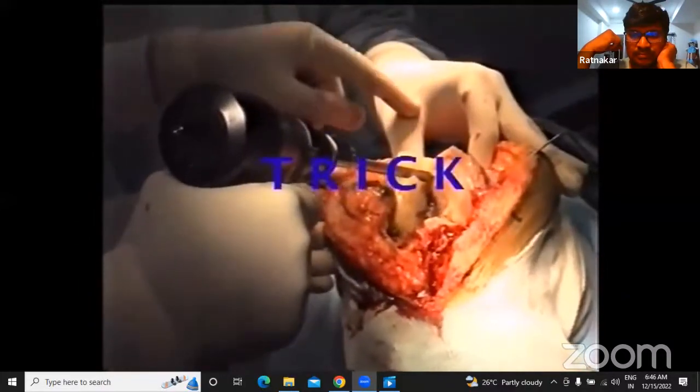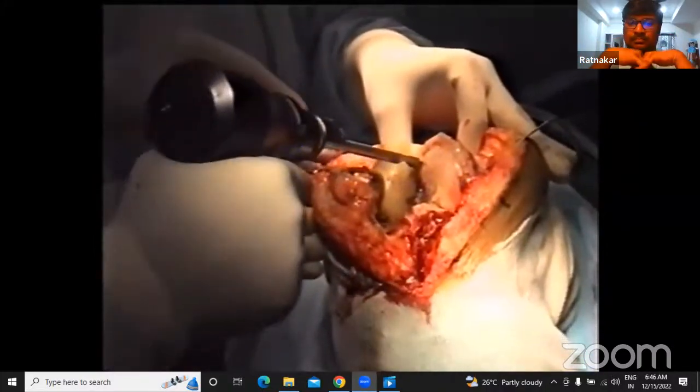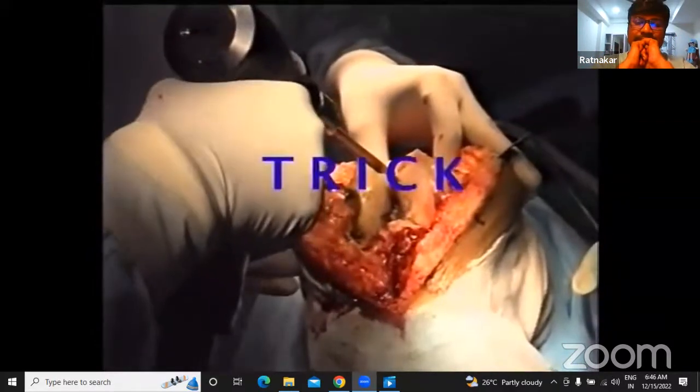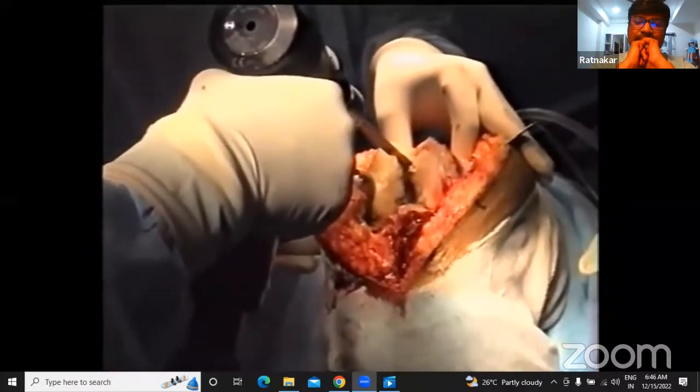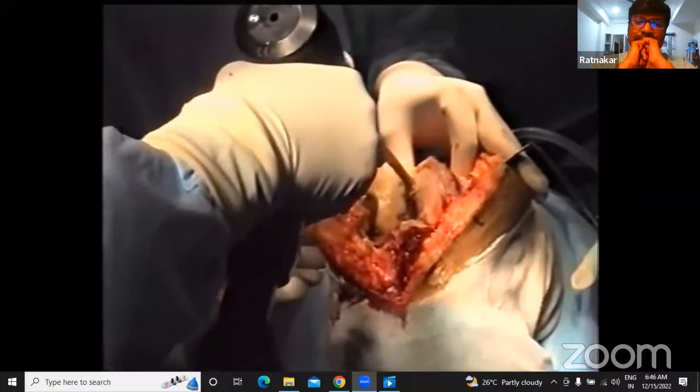Now this is my assistant's thumb and index finger. It's like a tunnel that will show me the dimensions of the femoral cortex, and he will also guide me this way, that way also. Once you drill the first 1 millimeter, let it go freehand. Don't put any force there.